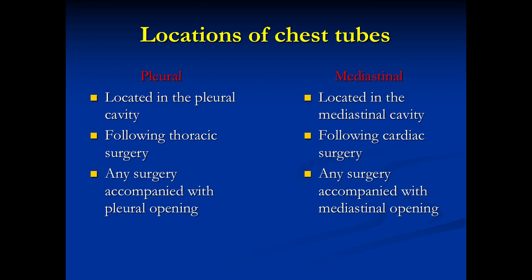دلوقتي احنا ممكن العيان مثلا بيعمل عملية رينال او حاجة زي كده وحصل injury للديافرام، وبالتالي البلورا is opened. في الحالة دي بنحتاج نحط زي chest tube في البلورا عشان تدرين الاير اللي دخل، او لو في اي شوية كوليكشن جم نتيجة الجراحة بتاعة الرينال سيرجري. تمام. فولنج طبعا ثراسك تروما، احنا كل العمليات بتاعتنا اللي بتتعمل في ثراسك تروما لازم يتحط chest tube درين بعدها.